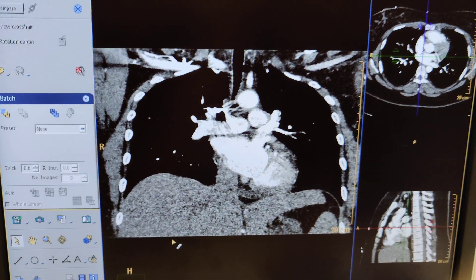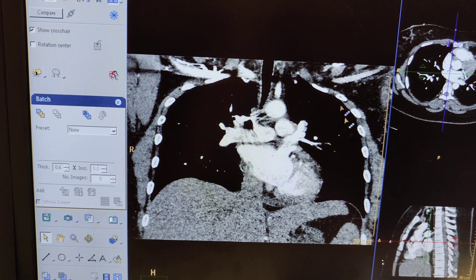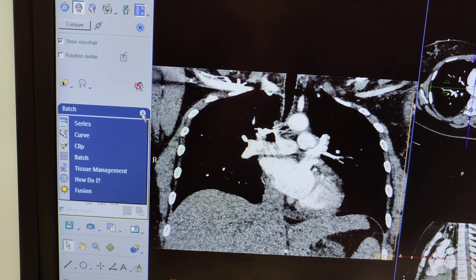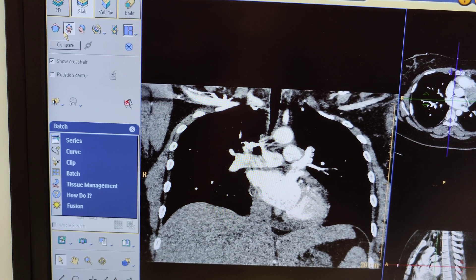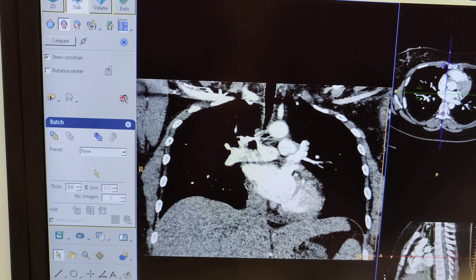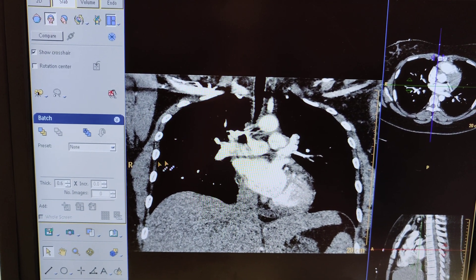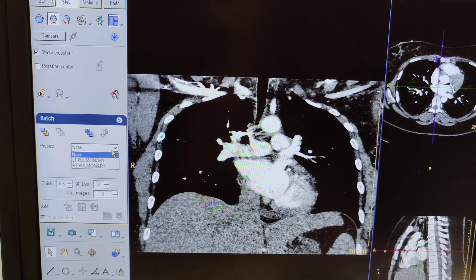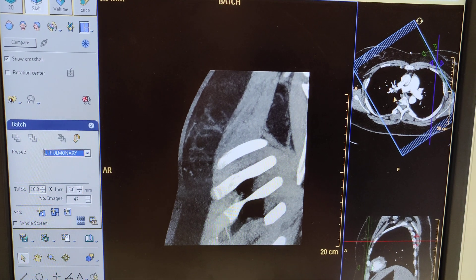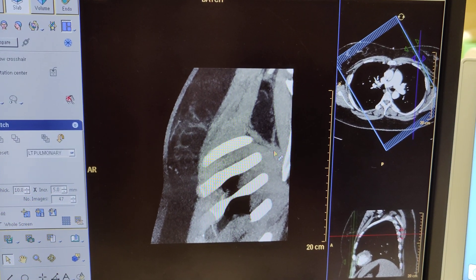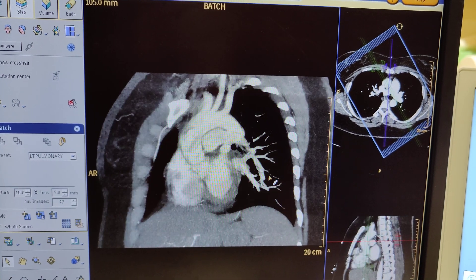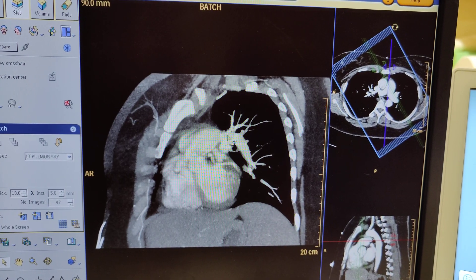Here's an example of a chest pulmonary scan. Make sure you're in coronal view, then click batch. When you're on here, go to your left side because that's what we're going to work on. Left-hand click and scroll through this pulmonary scan.